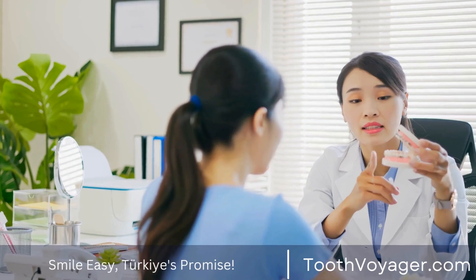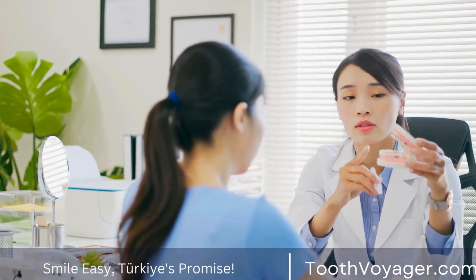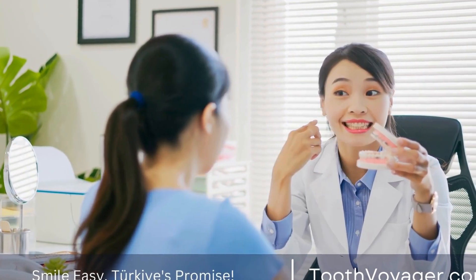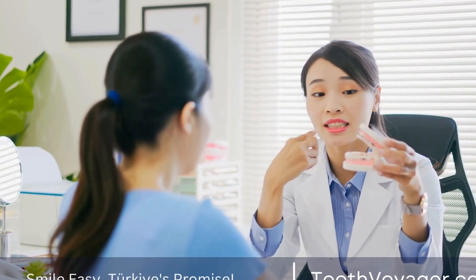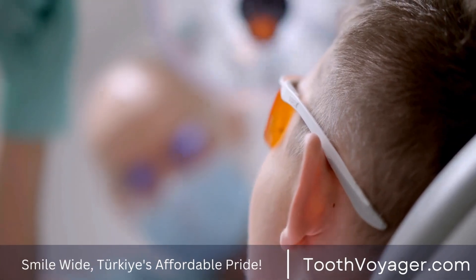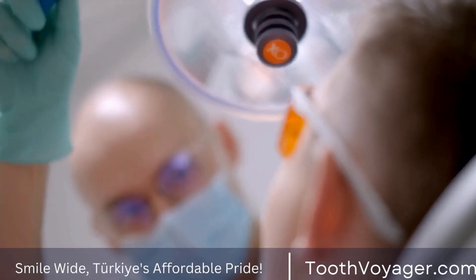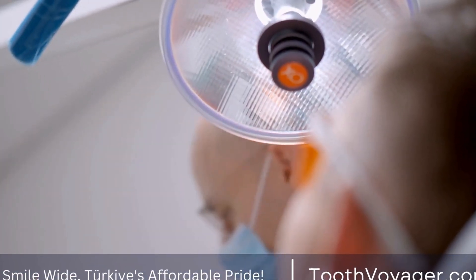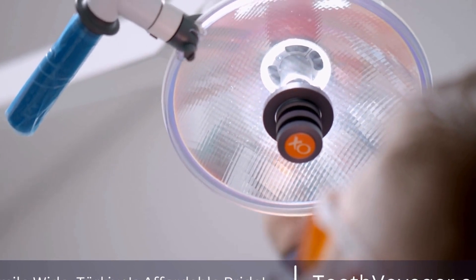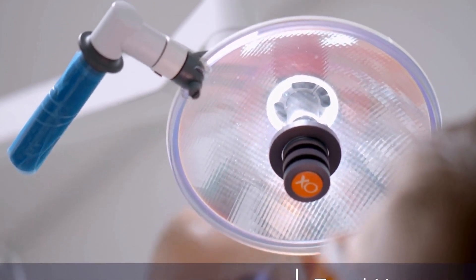The process of designing dentures to be comfortable requires a skilled dentist who is able to design prosthetics that are perfect for the mouth of the patient. The process requires a number of stages, beginning with an initial meeting with the patient to the fitting process of the dentures.